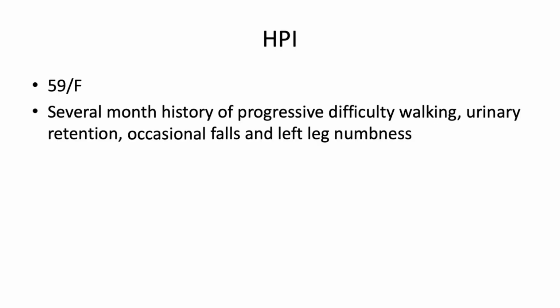Hello, my name is Walid Brunjikji, and today I will discuss a case of spinal epidural arteriovenous fistula embolization. Our patient is a 59-year-old female who presented with a several-month history of progressive difficulty walking, urinary retention, occasional falls, and left leg numbness.